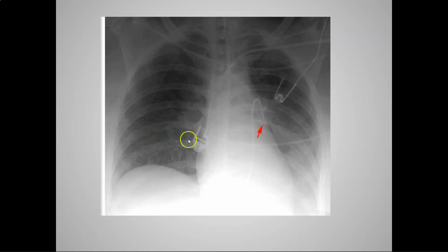And I'm going to move past that, and there's that chest x-ray I talked about earlier. You see them float the Swan-Ganz catheter, and you can see it even coming in over here. Look at it, right there. He's doing some clavicle here. We're going to go down. Superior vena cava, that's where we are. Okay, drop into the heart right here. Boop, boop. There, this is the atria. There's the ventricle. We floated back up, pulmonary artery. Ta-da! And we're where we need to be.